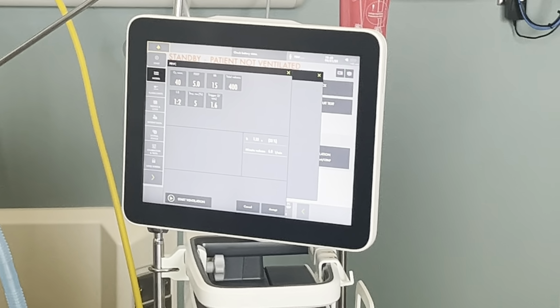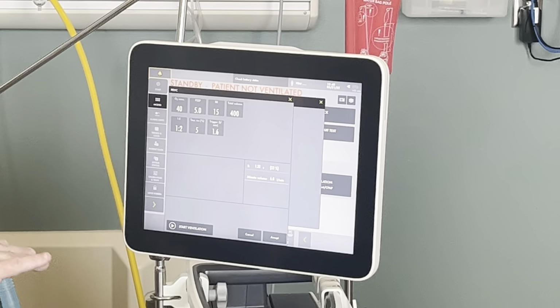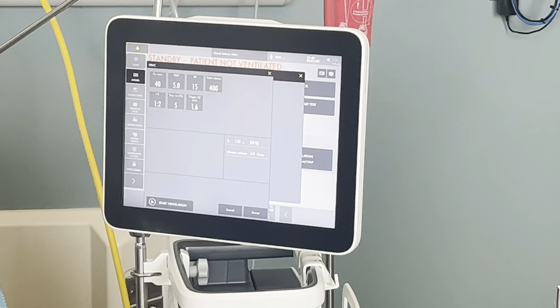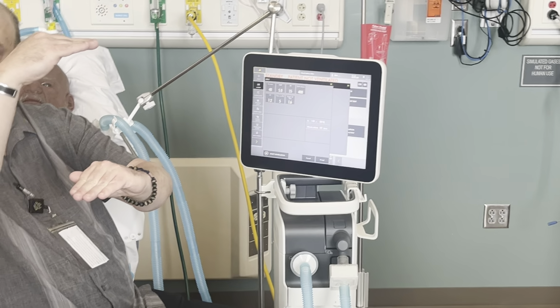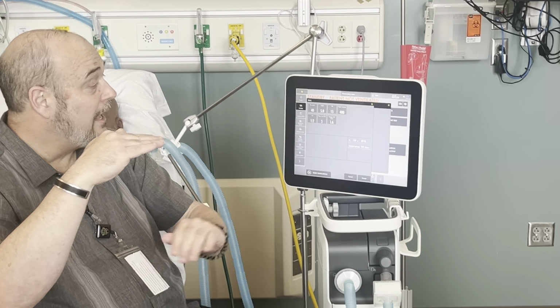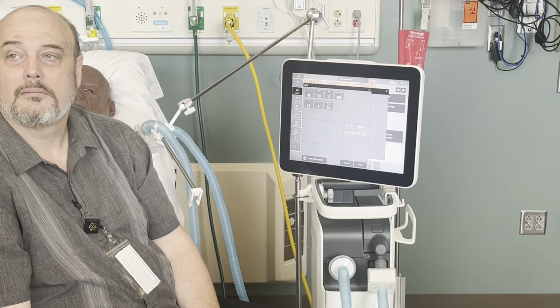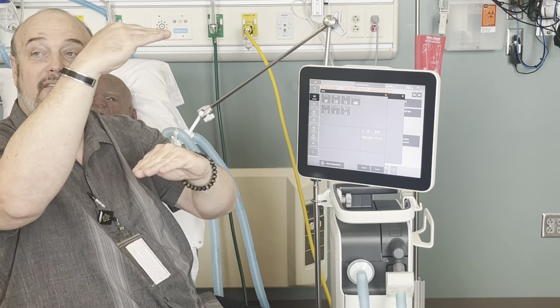Volume. Okay. Pressure, volume. So you guys haven't been through this part yet. This is the part that Marty's going to go over. You'll look at the waveforms. This is a pressure mode. So this is exactly like pressure control ventilation, except now I'm going to adjust the amount of pressure you get to get the volume that I set. So you remember in pressure control ventilation, I have a set pressure here and down here, and I don't care what your volume is. It's just going to deliver those pressures, right? And then I go over here to this one, I set a volume of 400, and it's going to go up and down those pressures using the exact same things to get that tidal volume in. And if you're only breathing out 350, it's going to go up a little bit on the pressure each time until it hits that 400.